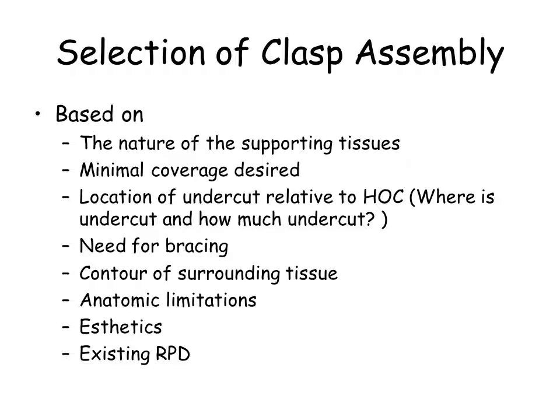Aesthetics is often a limiting factor in clasp utilization. Very high expectations can rule out the use of clasps. One should also consider the design of any existing partial denture. They can be very useful in deciding what works and what does not.